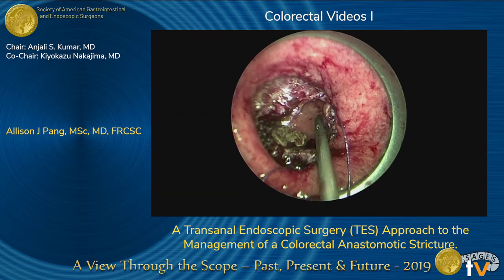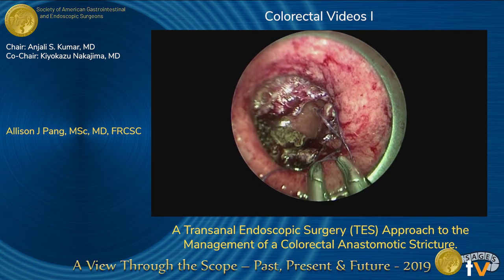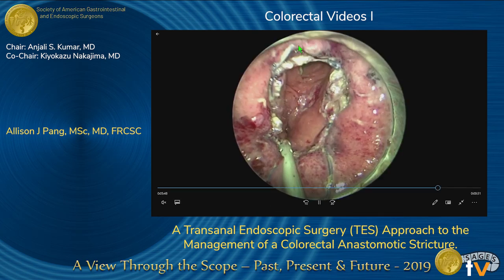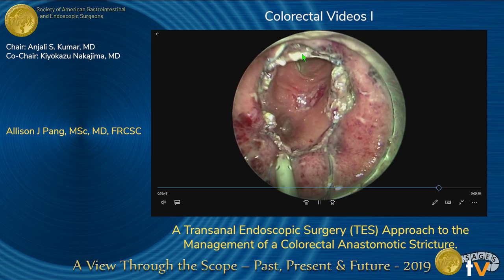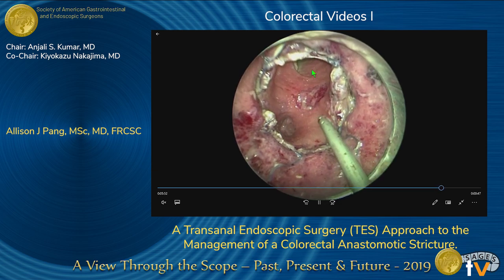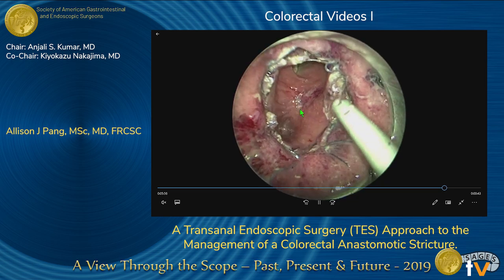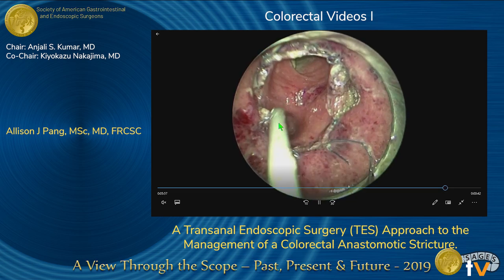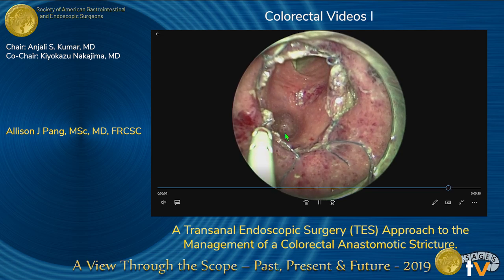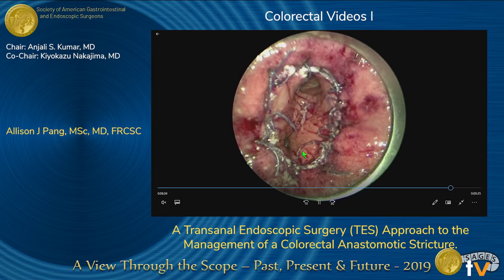Here we are almost done with the anastomosis. There are a few gaps still to close with interrupted sutures. Up at the top of the screen you are looking into the lumen of the proximal colon — this is just a small diverticulum proximal to the anastomosis. And this is the complete anastomosis in the end.